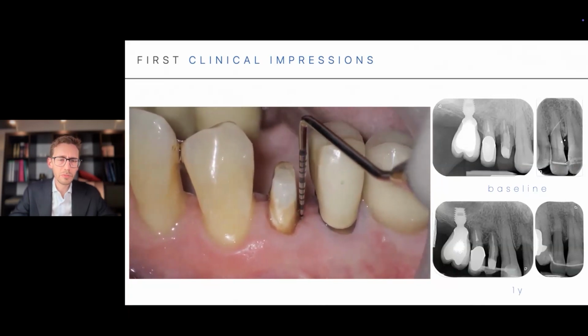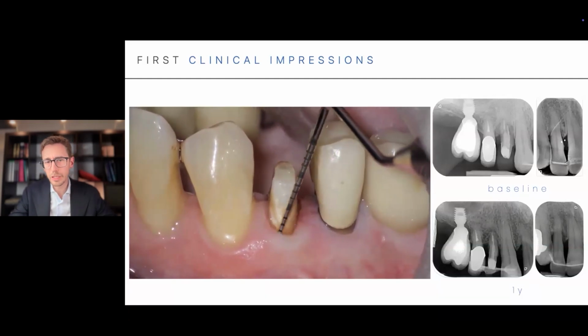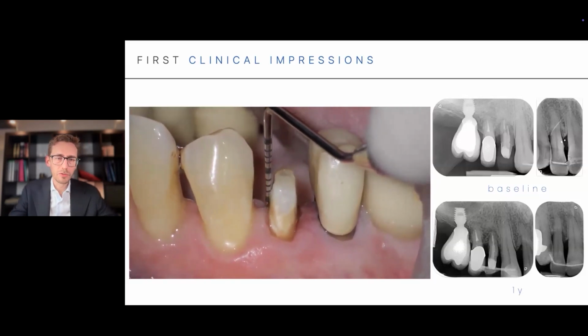And you see, of course, in the movie, the complete resolution of the pocket with the absence of bleeding on probing and the absence of residual probing, both at the distal aspect of 14 and at the distal aspect of tooth number 12.